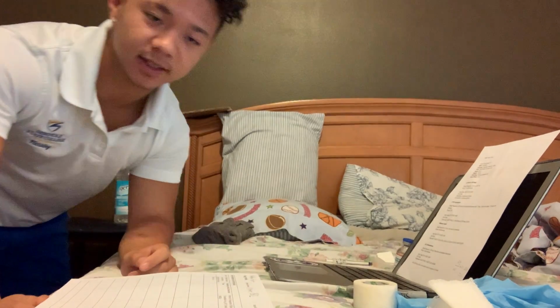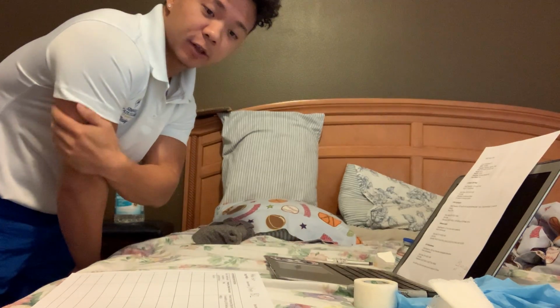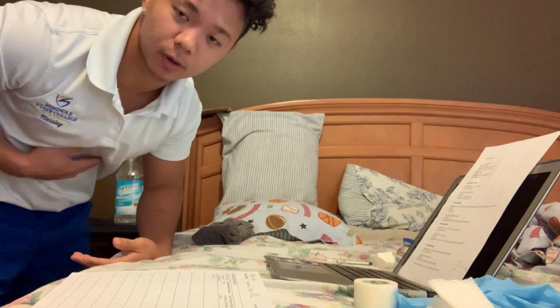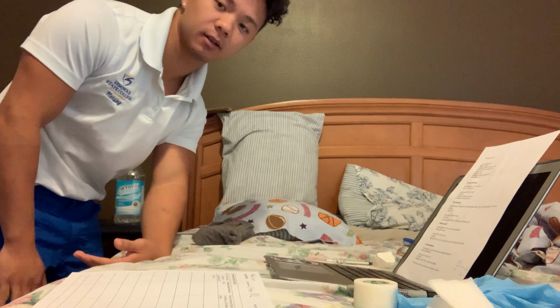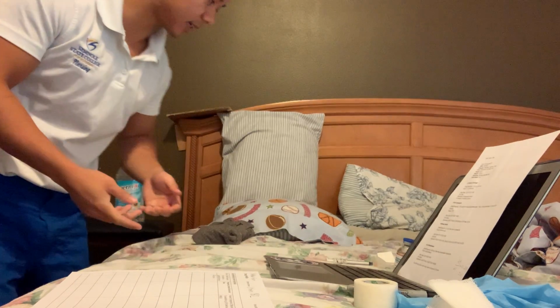I'm going to start off by identifying the 3 sites for subcutaneous injection, which is the outer posterior aspect of the upper arm, the abdomen from the costal margins to the iliac crest, and then the anterior aspect of the thighs. And then now I'm just gonna sanitize my hands.